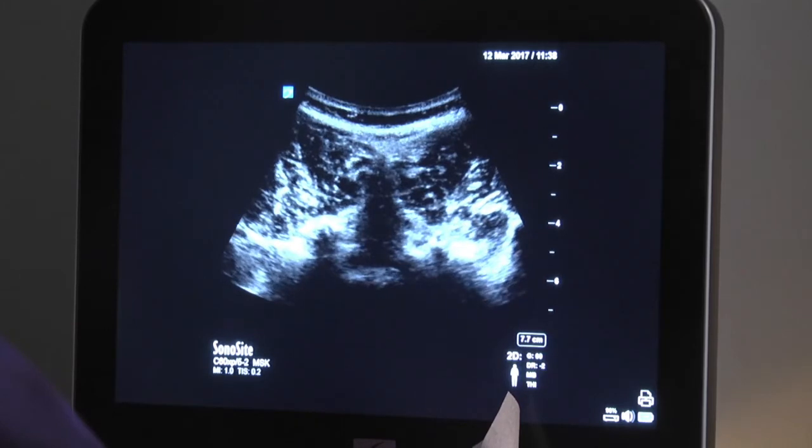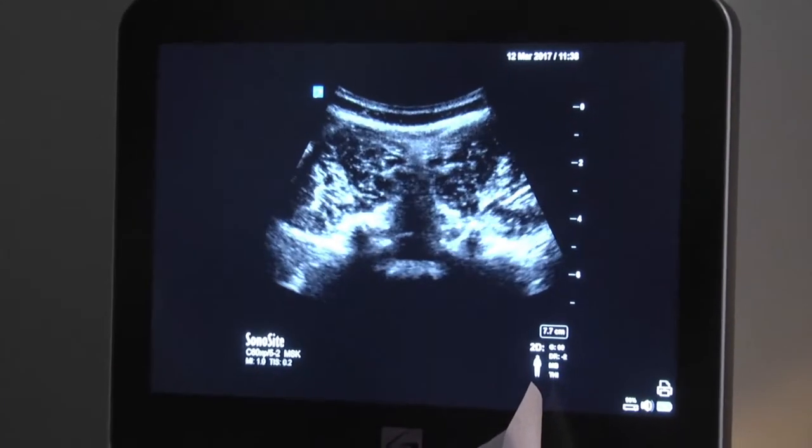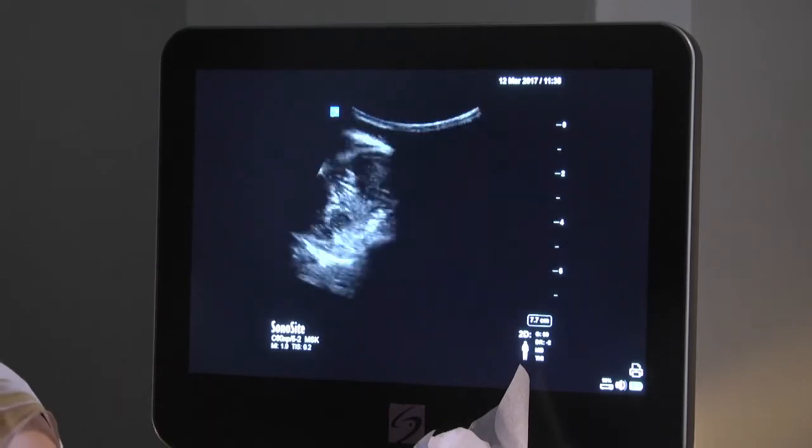And that should give you a rough idea. In some morbidly obese individuals, it may be 8 centimeters. So you need a long needle, because otherwise you'll be using that needle all day long. You'll never get CSF. Okay, so let's do a sagittal scan now.